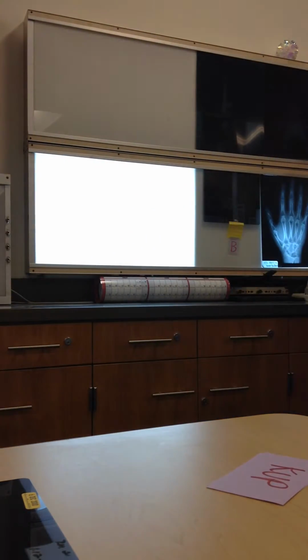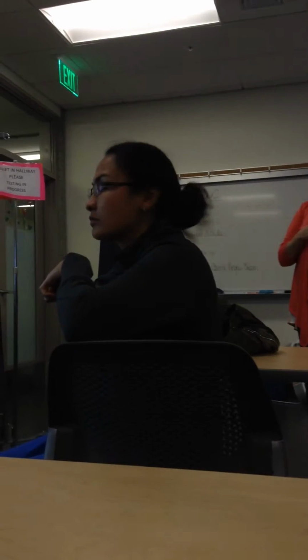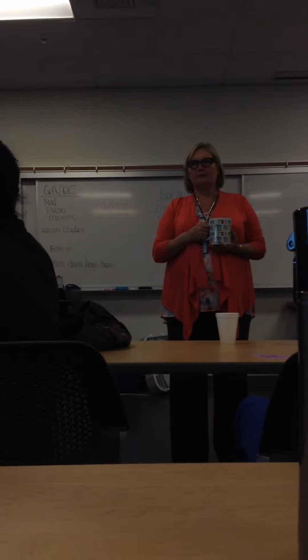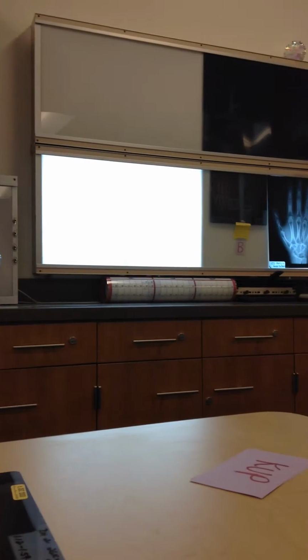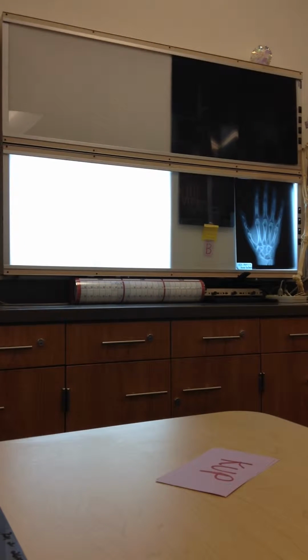How would we measure half value layer? And what else? The aluminum layers, yeah. Okay, who else? You can put that in the back. What else? You guys go down. Okay. No one touch the table.